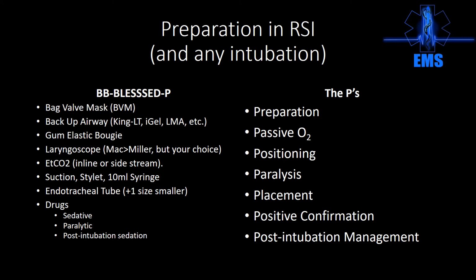Obviously, the laryngoscope. Mac or Miller. Most people have greater success with a Mac, but if you are a Miller person, great. However, in this day and age, I would argue that the vast majority of your intubations need to be video laryngoscopy, or VL. I think DL still has a role, but we are finding that the greatest success in EMS and in emergency medicine, for that matter, comes with VL. If you take the difficult airway course, the instructors will all tell you that they have not done DLs in years. They work in really privileged hospitals that have VLs on the wall in every room in their resuscitation bay, and they just do video laryngoscopy all day with great success.